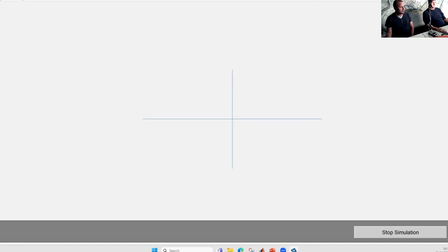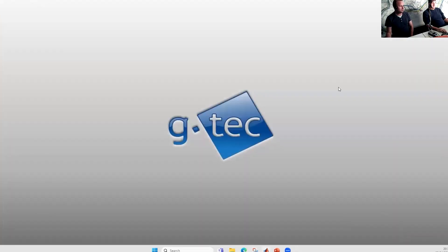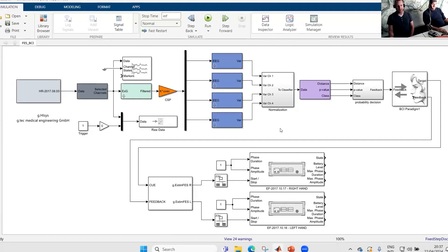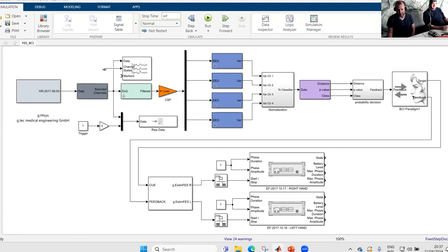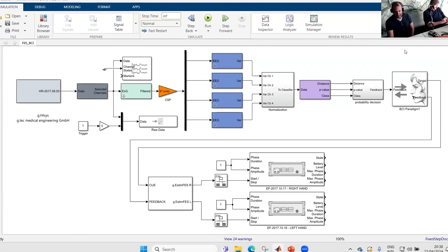I think we can stop that now because you got the idea of how this can be controlled. This is an example of how to do an experiment in Simulink — closed-loop experiments using the EEG and giving feedback through the FES devices. You also have the visual feedback with this paradigm. Another option is to stimulate not the muscles as we did now, but we can also stimulate the brain directly using transcranial magnetic stimulation.